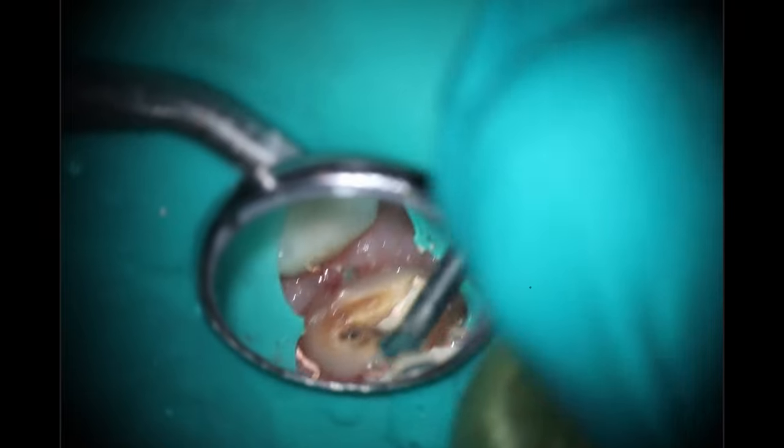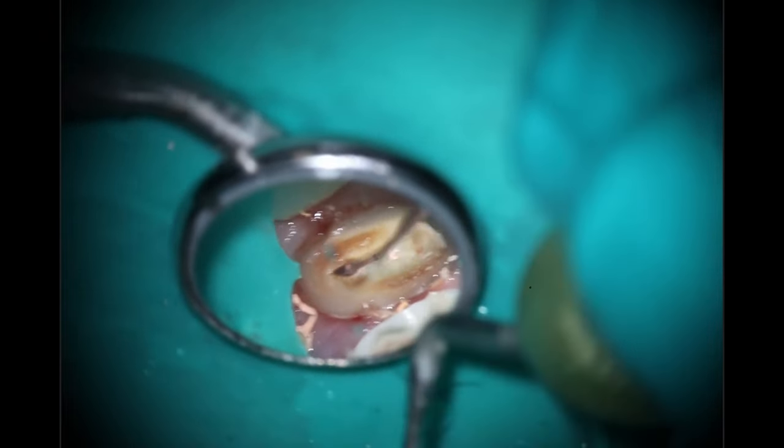Speeding up here, just cleaning all the junk out — making sure we get all that nastiness out so there's a nice space for the composite to get inside there and seal everything up. Normally I use the Brasseler 50/04s. Since switching to their VT Scout files, they don't remove as much tooth structure, which is why I switched. But on really small cases like this where the shape is pretty much just what the file is, the 17/04 doesn't remove enough tooth structure and the 50s don't fit.